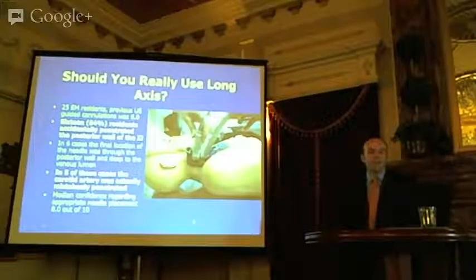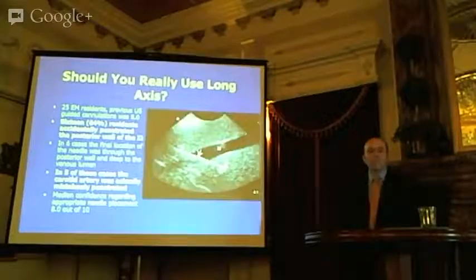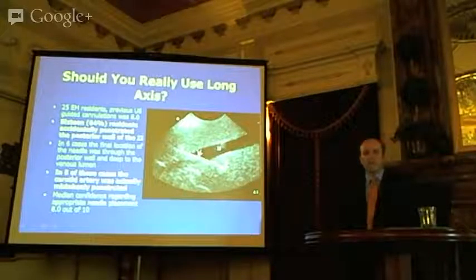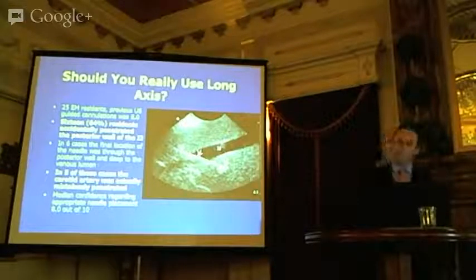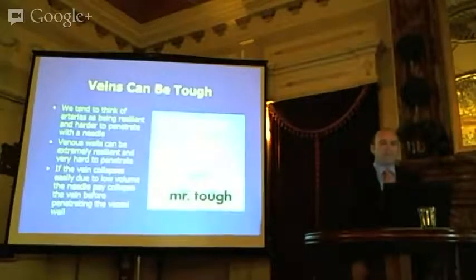And we had a lot of people not know where they ended up, not end up in the vein. In fact, we had a lot of people go all the way through. And even in this unrealistic phantom, because a carotid is not right next to the vein like it is in most humans, in this particular phantom model, it's an older one, it's like halfway up out of the table. But people still manage to cannulate the carotid. So, it's very easy to get lost.